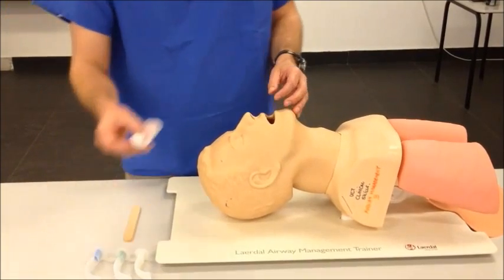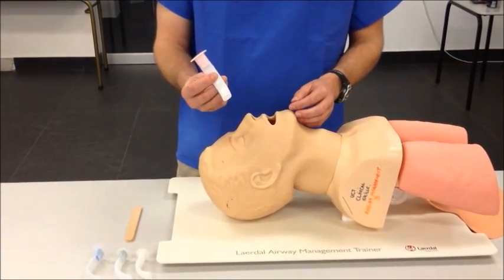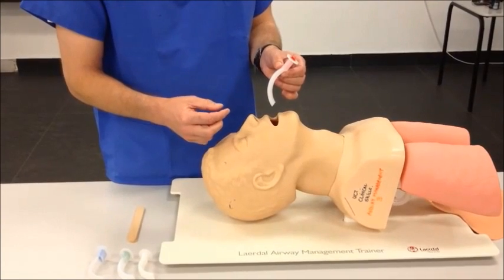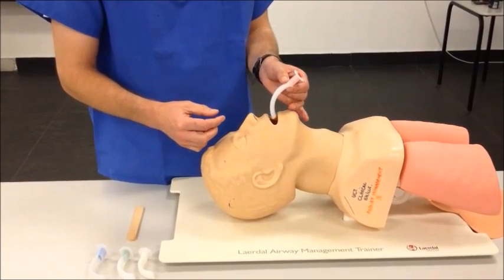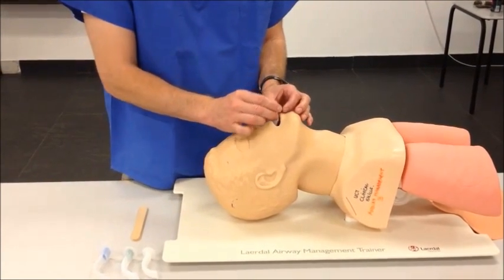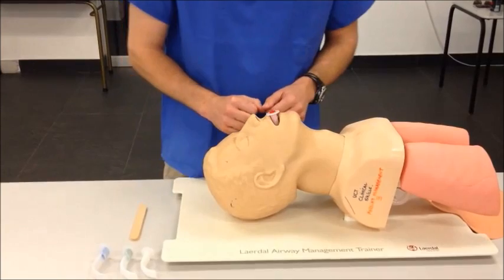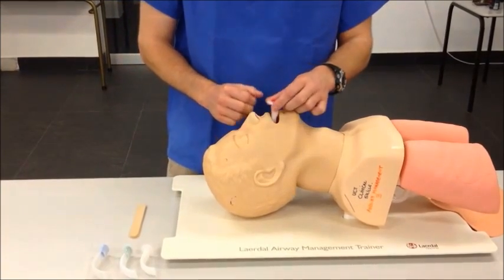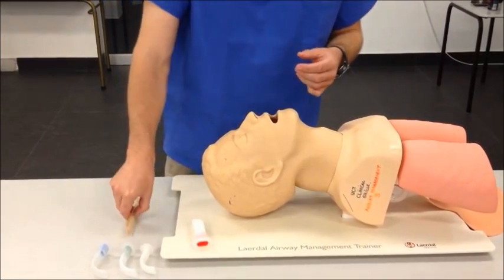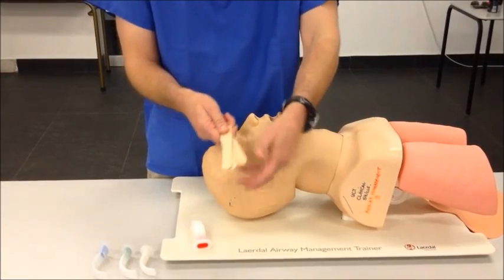The optimal way to insert the OP airway is to insert it in the position of use. You could initially simply try to slide it gently into the mouth, but if the tongue or other soft tissues obstruct this insertion, an easy way to get around that is to take two or three tongue spatulas.